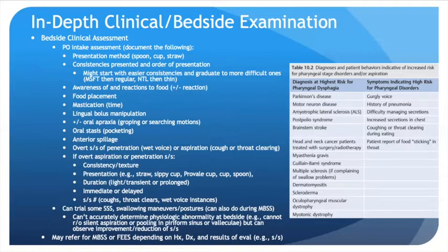You will want to look for overt signs and symptoms of penetration, perhaps a wet or gurgly voice, or aspiration, cough or throat clearing, perhaps. And again, remember that silent aspiration can occur. Just because the patient doesn't cough, that is not definitive evidence that the patient is not aspirating, right? If there are overt signs and symptoms of aspiration or penetration, what was the consistency or texture of food or drink that they aspirated or penetrated on?